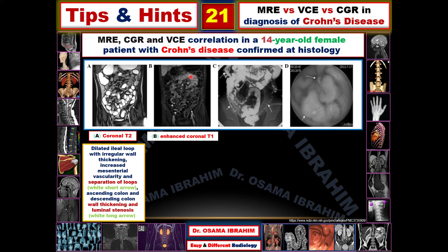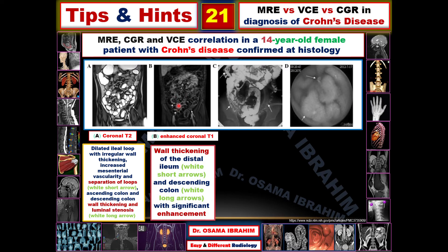The T1 sequence with intravenous contrast — the enhancing coronal T1-weighted image — shows enhancement of the wall of the terminal ileum with wall thickening greater than 4 mm, confirming abnormality. There are also areas of enhancement in the descending colon appearing as high signal in the bowel wall. Skip lesions are another diagnostic feature of Crohn's disease visible on this enhancing study. This child was confirmed histopathologically as Crohn's disease.